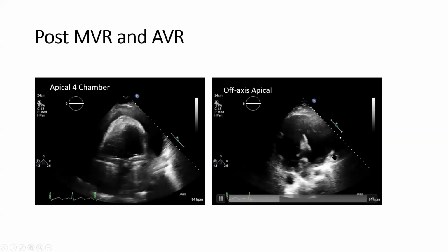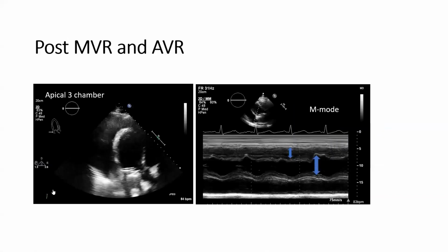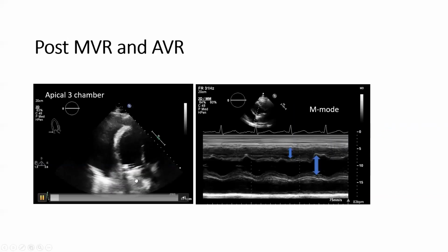And you can see a lot of moving, almost like contrasty areas, which indicate that this is either blood or a fluid that is very rich in protein, and definitely an exudative pericardial effusion. Same patient, apical 3-chamber view, large effusion, the exudate. And of course, this view was done with the aim of showing the effusion. So that's why you're not seeing the rest of the pictures that well.